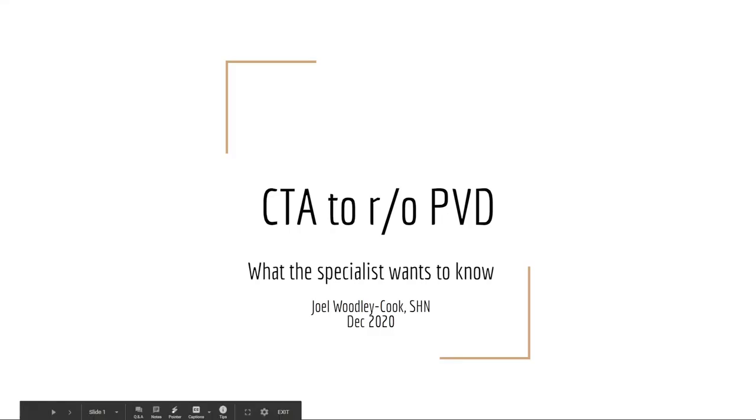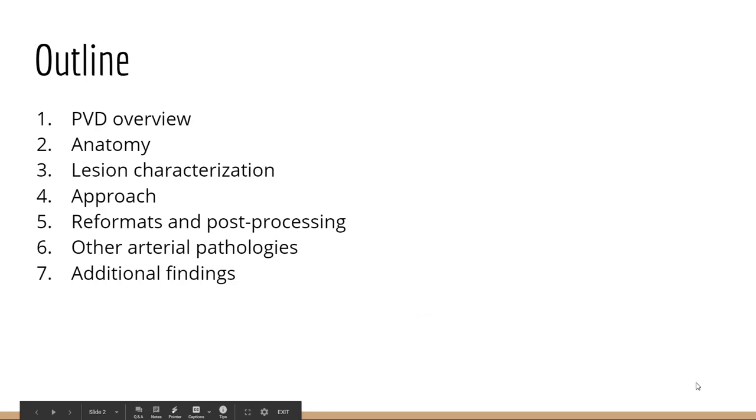Hello, I'm going to be giving a talk on CT runoffs to exclude peripheral vascular disease, everyone's favorite topic at around midnight on call, particularly in those with background peripheral vascular disease.